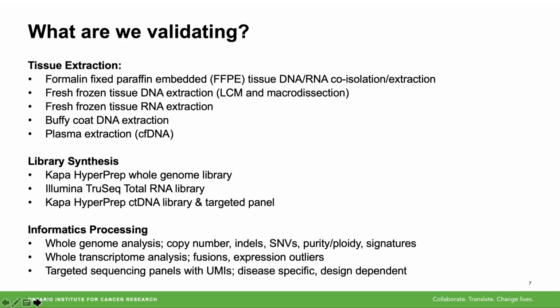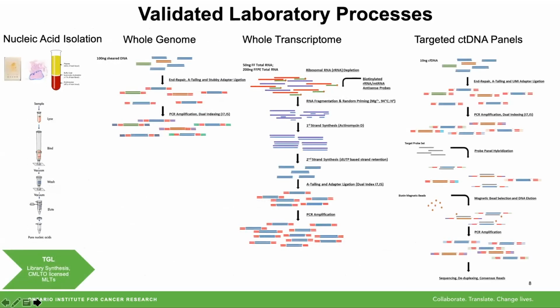We use a variety of automated processing methods, and so as part of our validation, we have looked at our whole genome analysis pipeline, as well as transcriptome and our targeted sequencing-based UMI panel processing. Next slide, please.